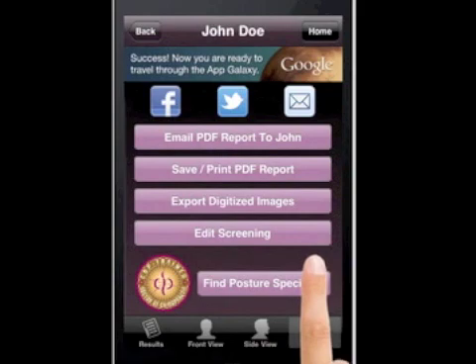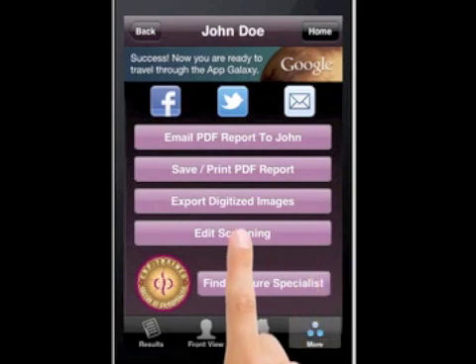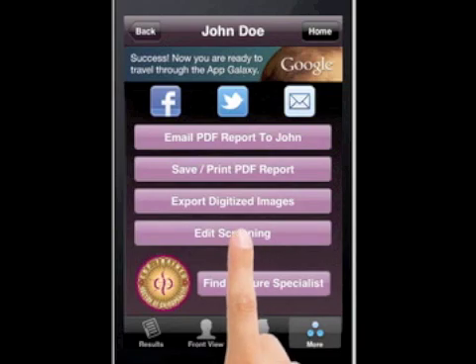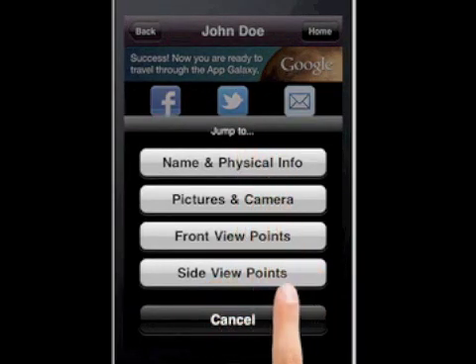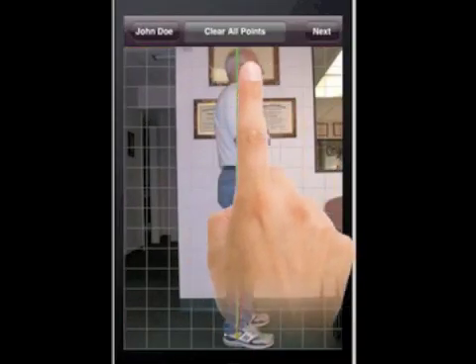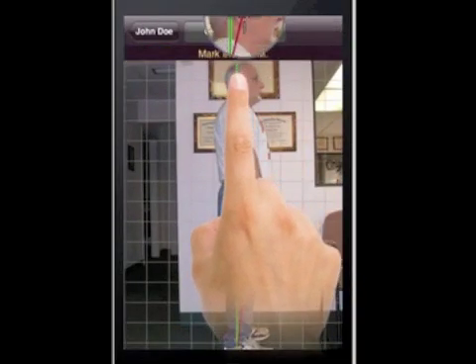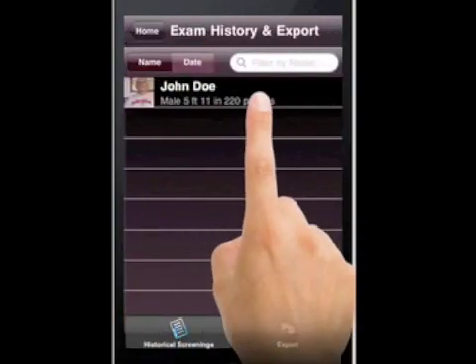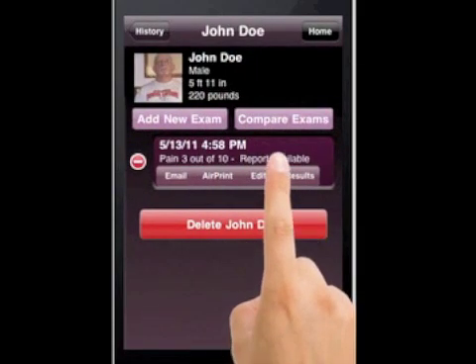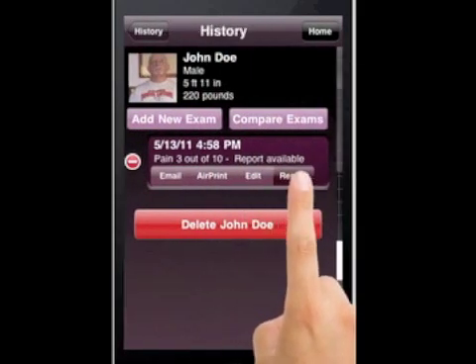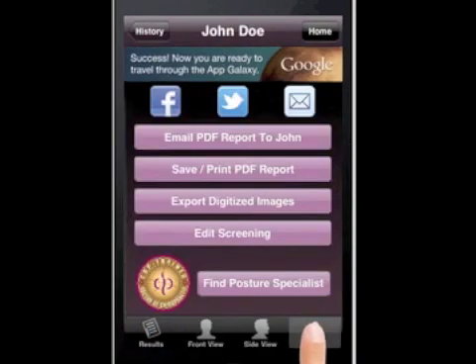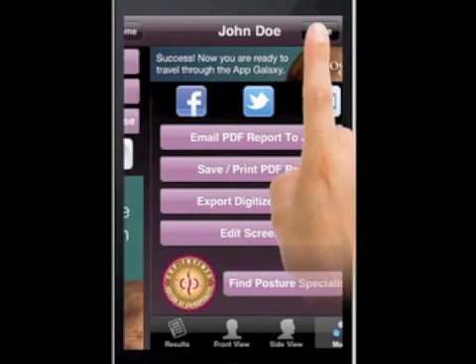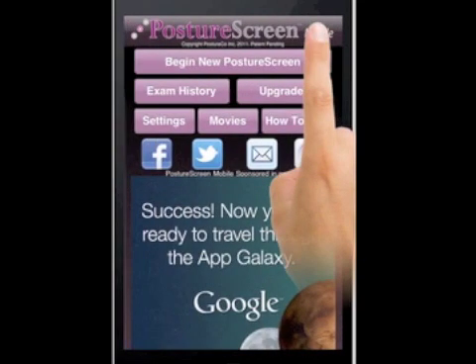If you wanted to come back and edit a screening, you can do that at any point in time. Hit Edit Screening, choose where you want to edit — say the side view points — come back in, move that point if you wanted to, then hit Next and go back to Exam History. We come back to the results screen. When we're done, we hit Home. And that's as simple as the screening is.